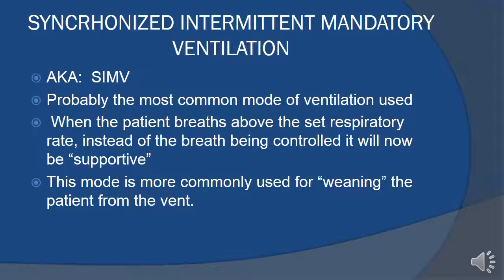Welcome to Modes of Mechanical Ventilation Part 4, and we're going to talk about Synchronized Intermittent Mandatory Ventilation, also known as SIMV. This is probably the most common mode of ventilation that's used today.